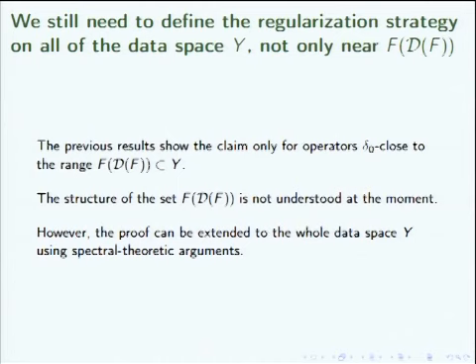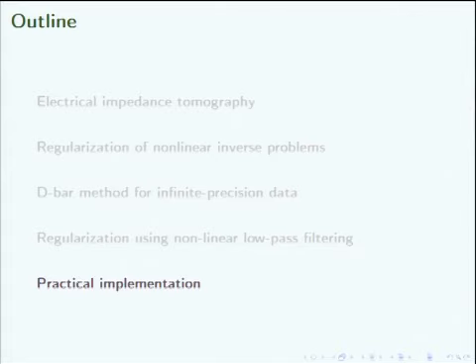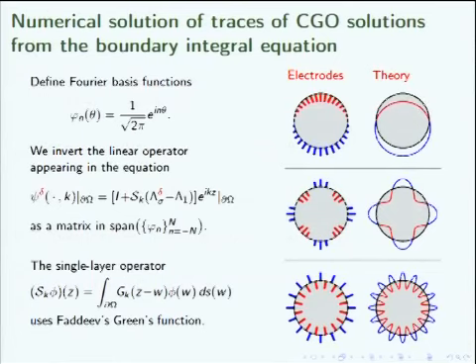And to my best knowledge, this is really the first time when a nonlinear inverse problem is regularized in this way. And then let's see how this works in practice. So what we do in practice is that, of course, we measure our data using electrodes and some current patterns. Usually currents are applied and voltage is measured, and several different current patterns are used.